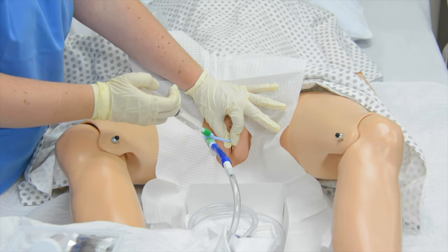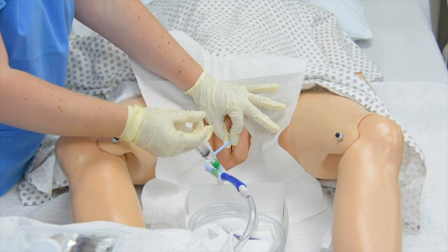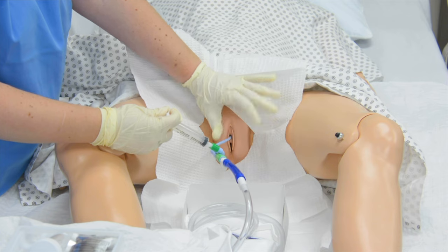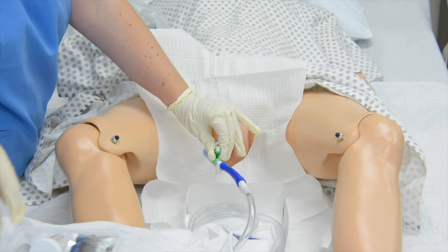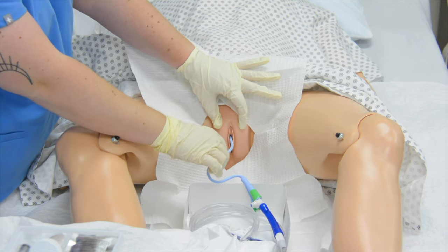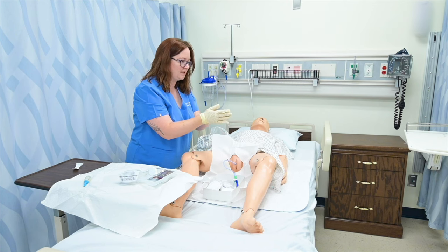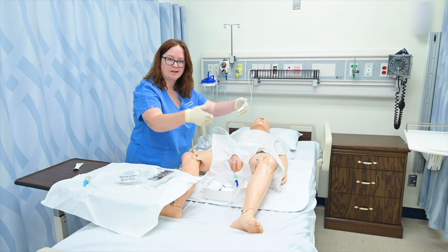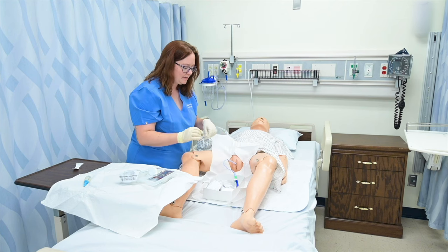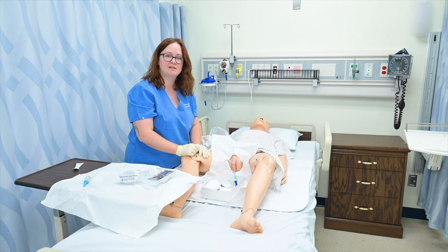I'm going to inflate the balloon — steadily inflating the balloon. I can now let go and disconnect my syringe. Then I want to grab this tubing and pull it down until I feel a slight resistance — just a gentle tug so that the balloon settles into the opening of the bladder into the urethra so that no urine can go around the balloon and leak around the tubing. Once that's done, I can go ahead and secure the bag to the leg and make sure my patient is positioned safely.